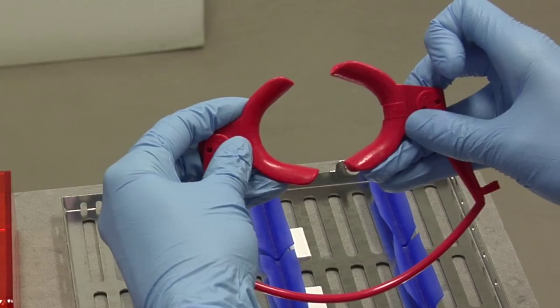Hey guys, it's Dr. Venatelli. And I just wanted to show you how the braces go on a patient's models before they're actually placed in the trays that transfer them into a patient's mouth.